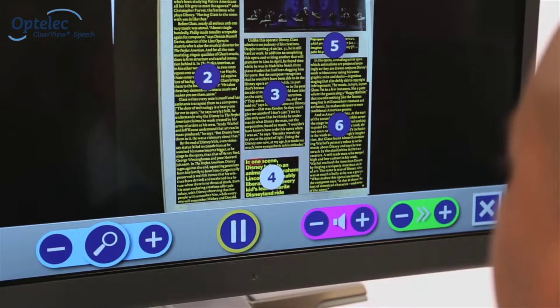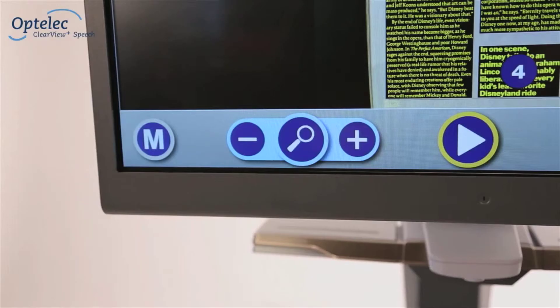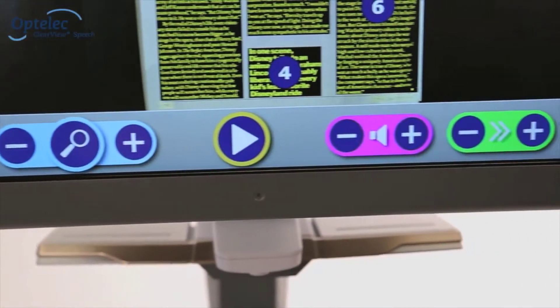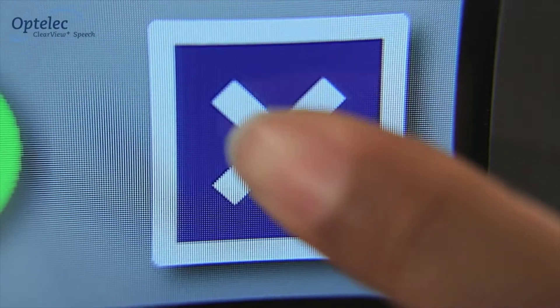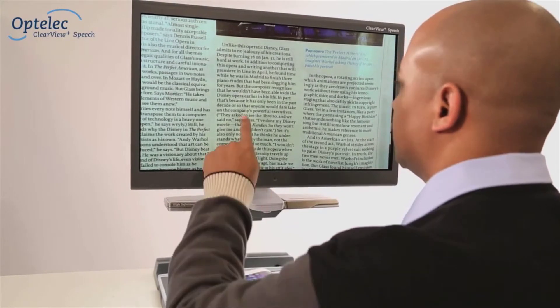Select a paragraph on screen and the Clearview Plus Speech will read it aloud. The button bar allows you to pause the read-aloud function, adjust the volume, and adjust the speed. Pressing X will switch off the speech option and will take you back to the Clearview Plus mode.